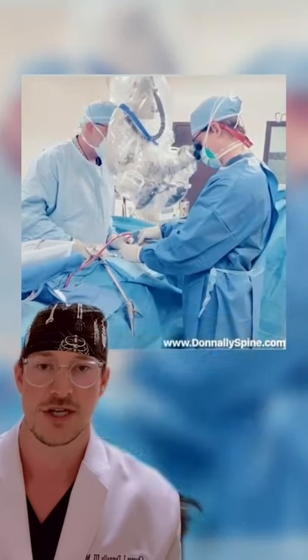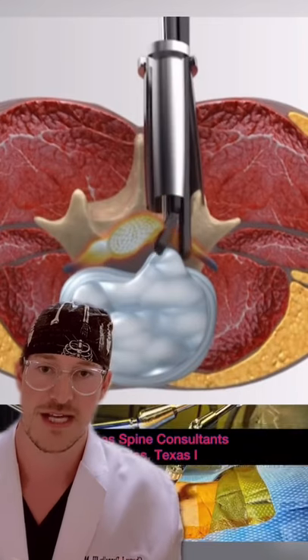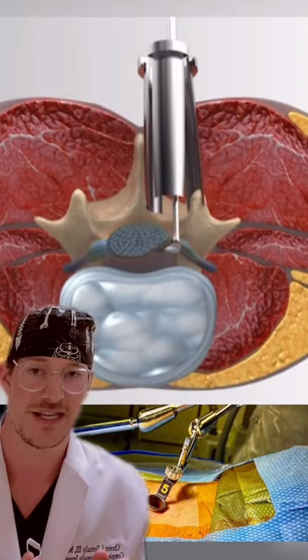Here's another view of how this looks. The probe goes down and moves the nerve roots to the side. You find the disc herniation and you pluck out that disc herniation in a minimally invasive fashion.